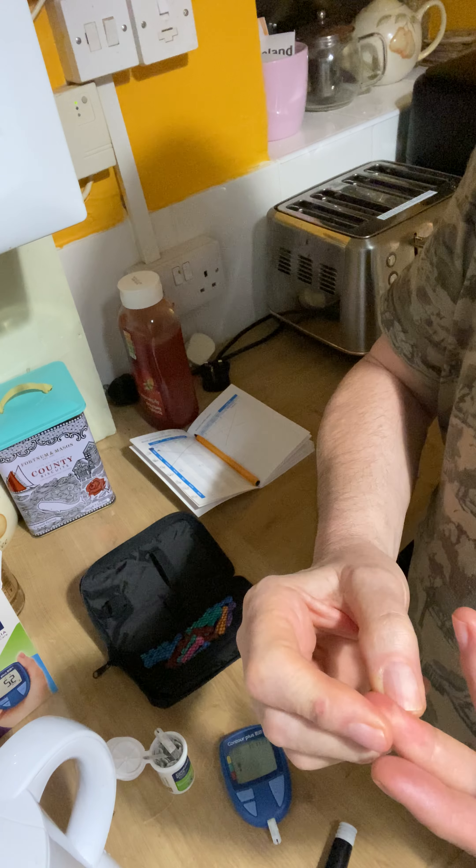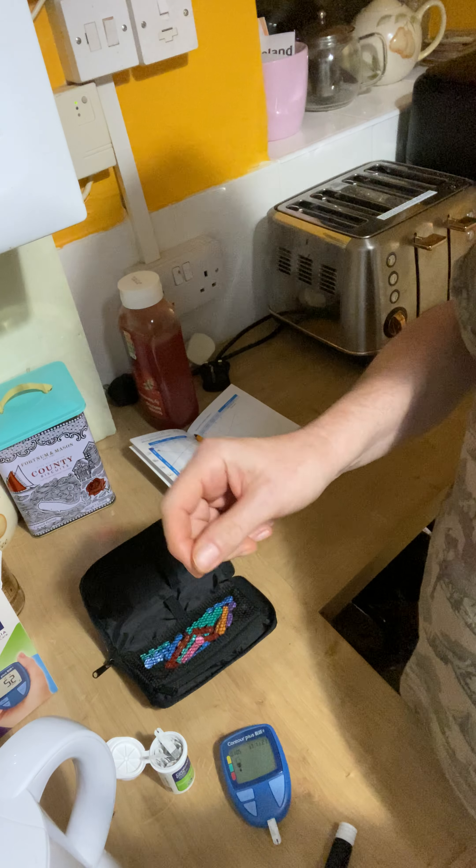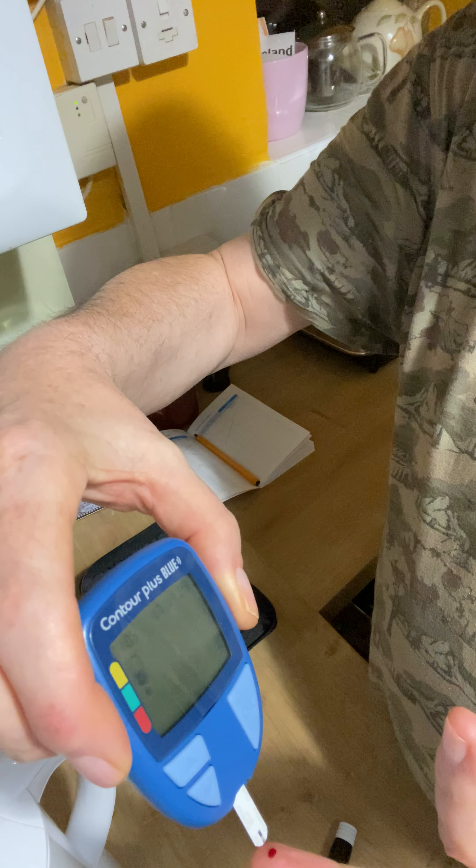Not much blood coming out of there — here it comes, blood. See it? Then we get this and it sucks it up.